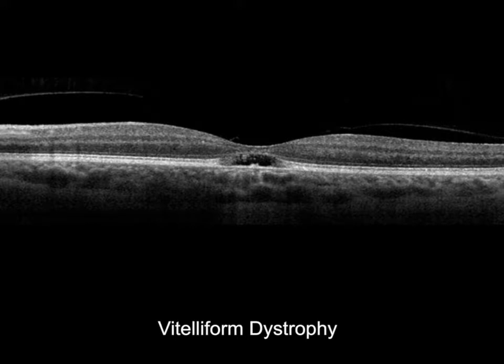So for these individuals with things like vitelliform dystrophy, we can simply watch these individuals and manage them in the office so that they don't have to go to retinology if they don't need to, barring consistent vision and consistent appearance of the macula over time. That's one of the key things that we look at with all of these scans: the repeatability of the scans and determining how stable or unstable these individuals are.